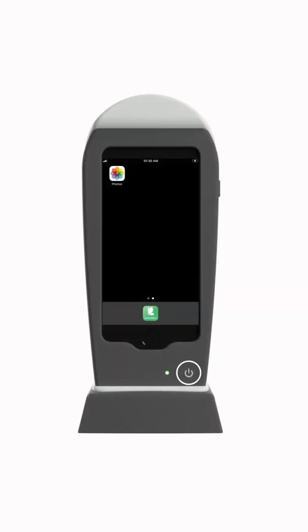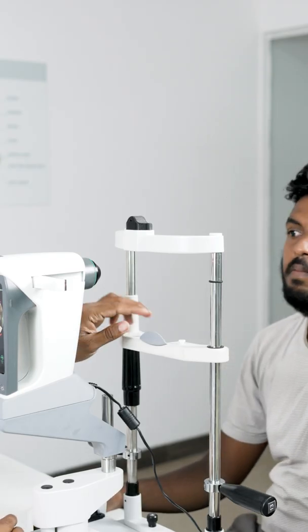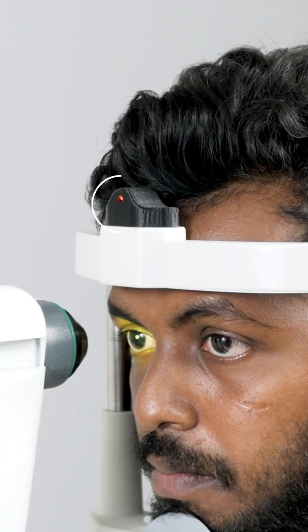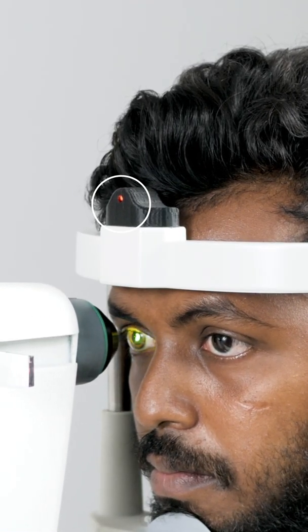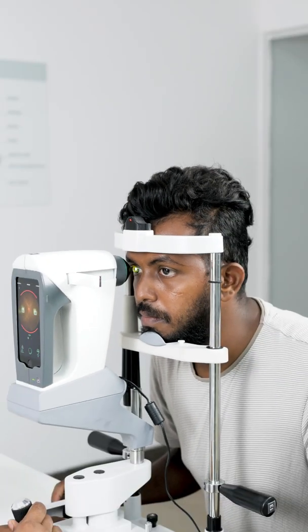First turn on the device, then turn on Bluetooth so that the mobile and the device can connect. Once the patient is seated, ask them to touch the top of the chin wrist with their forehead. A red light will show here indicating that contact is made. This contact ensures the right posture for image capture.